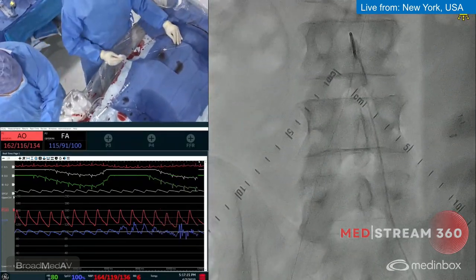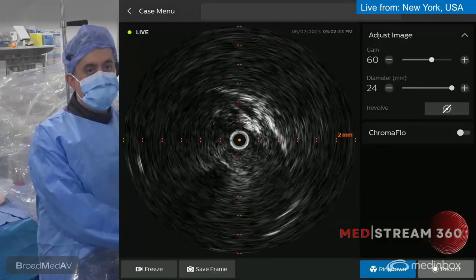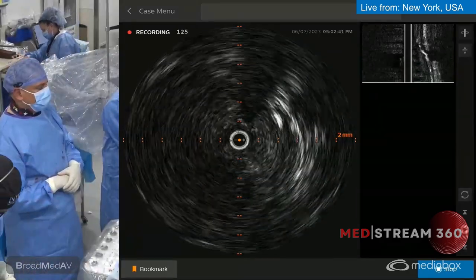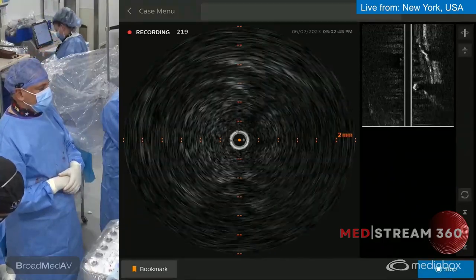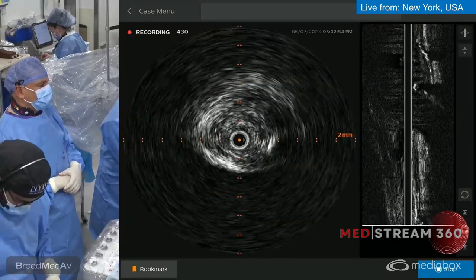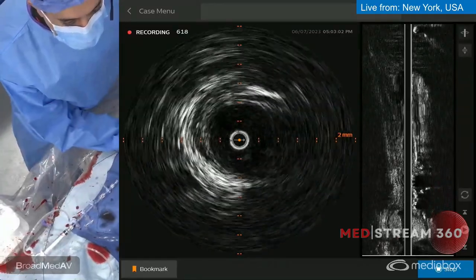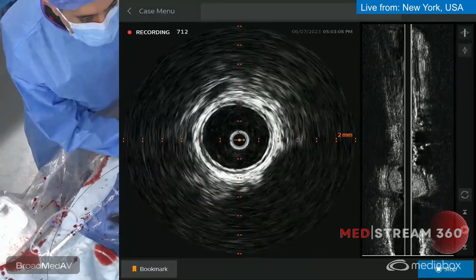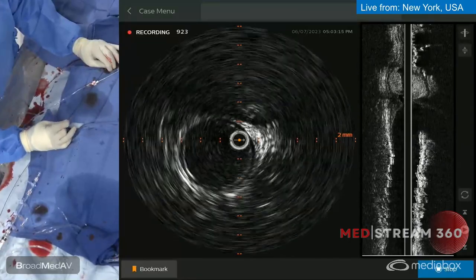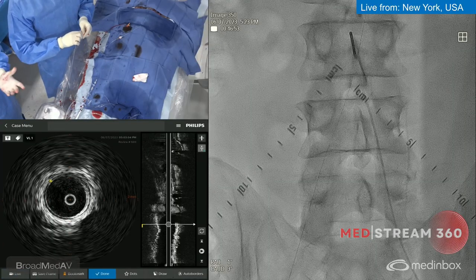We just felt this should be a bailout if we couldn't cross. Now that we're through, we're doing a quick IVUS — pulling back and recording. You can see the IVUS in the aorta, the catheter moving, and as we come down we're in the vessel all the way. Right about there looks like the CTO. Increasing the gain — it looks like we're in the lumen, right in the center, maybe slightly subintimal there, with a lot of debris. Then we came out into the true lumen. It appears to be a retrograde dissection with the flap tacked up by the occlusion.